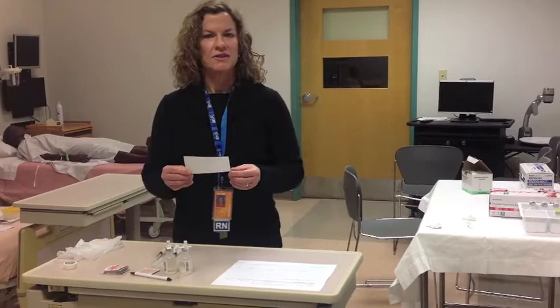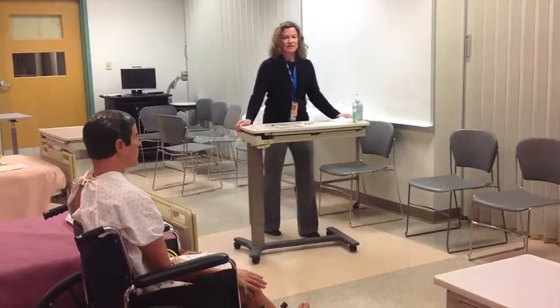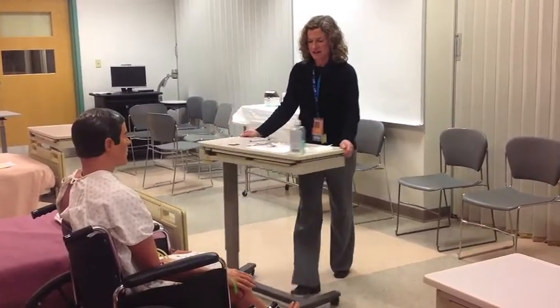Now I'll check my note card to review information about the medication, and then I will get my supplies and go into the room. Now I'm going to enter the room with my supplies.